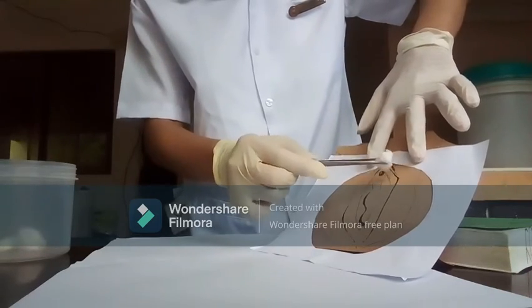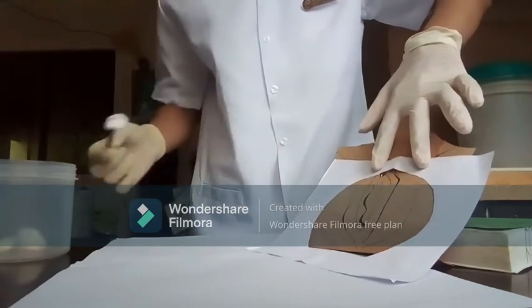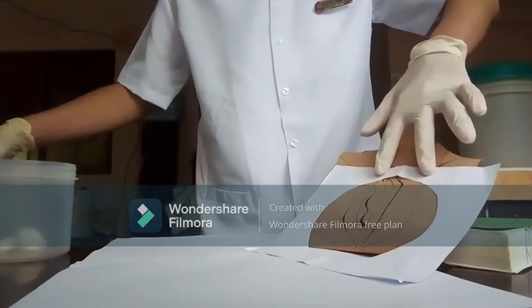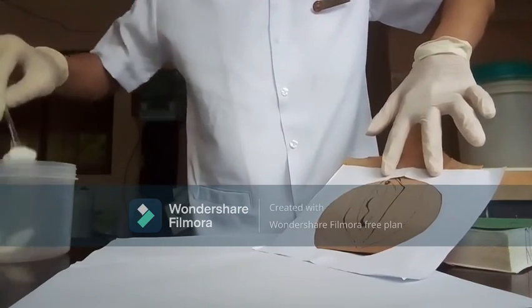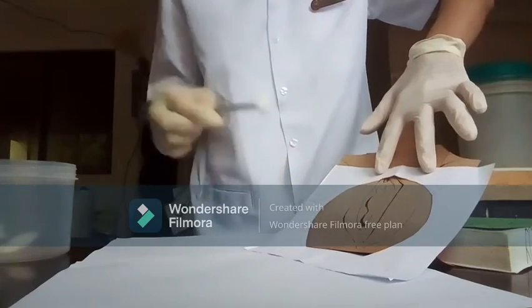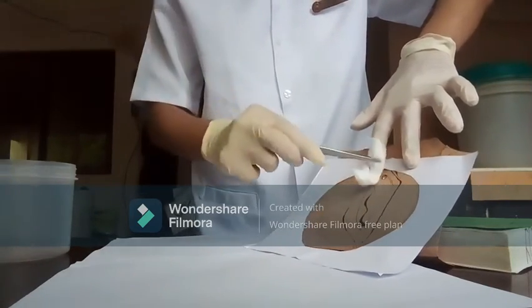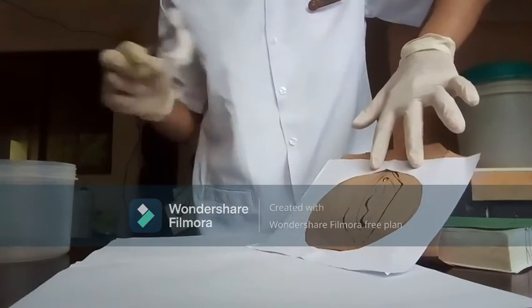First here. So we're going to use another cotton ball in the middle, from top to bottom, then wipe. Okay.